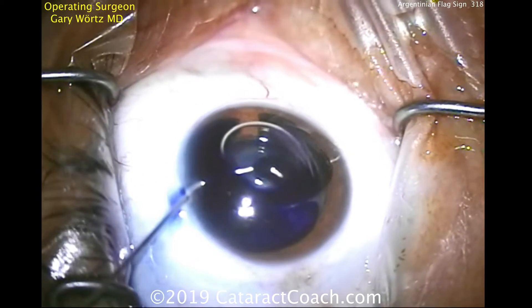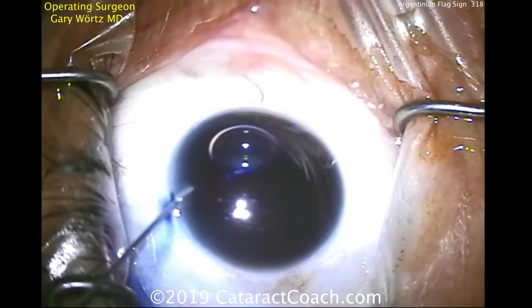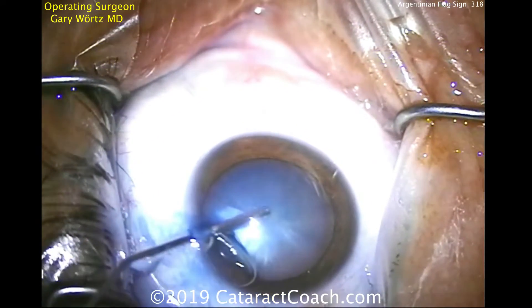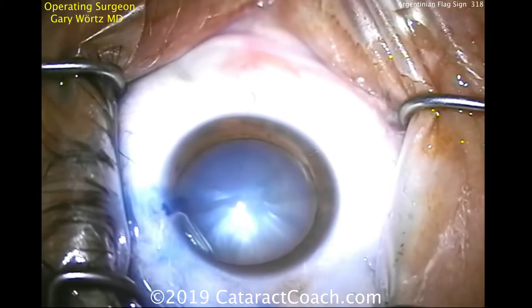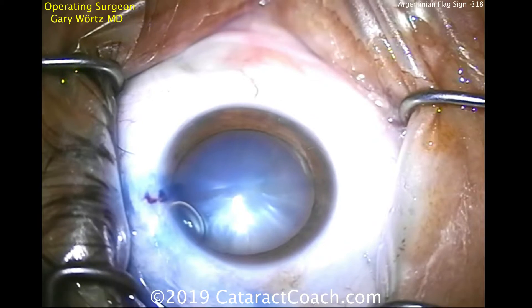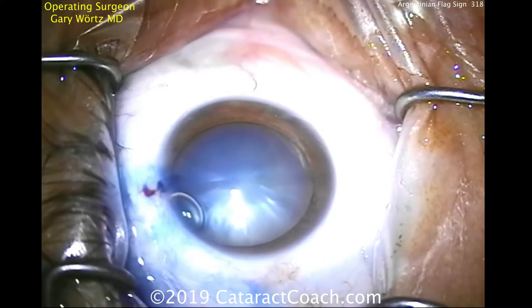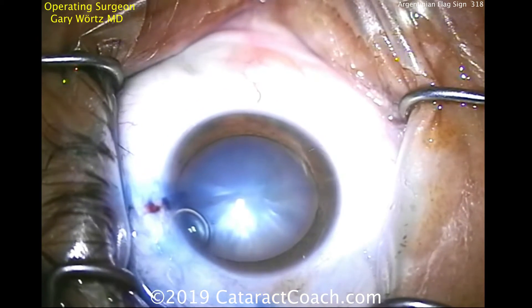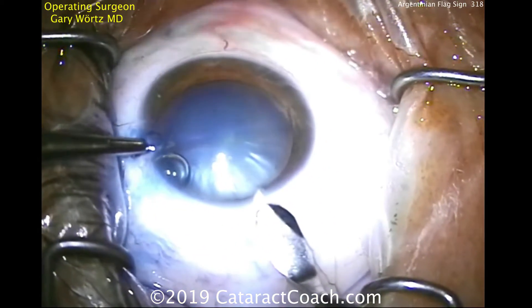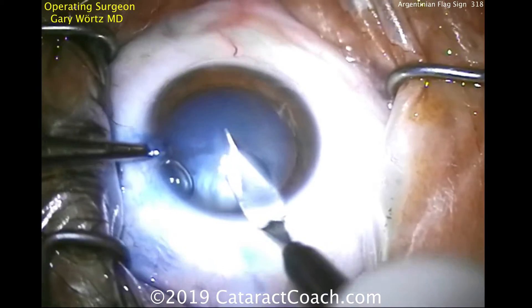He's instilling TriPan Blue dye inside the eye, filling it up with viscoelastic, and now you can see that really is a very opaque white cataract. The TriPan Blue dye is essential here for staining. The catch is that if the pressure in the capsule bag is higher than that of the anterior chamber, you can get the capsule to split.